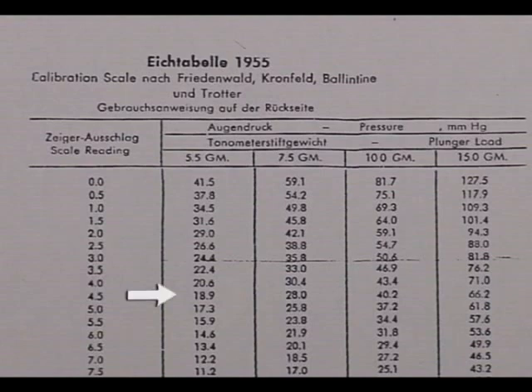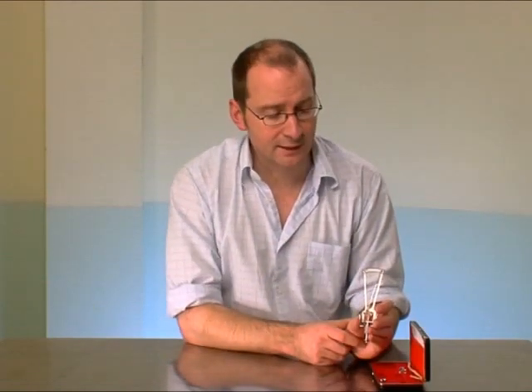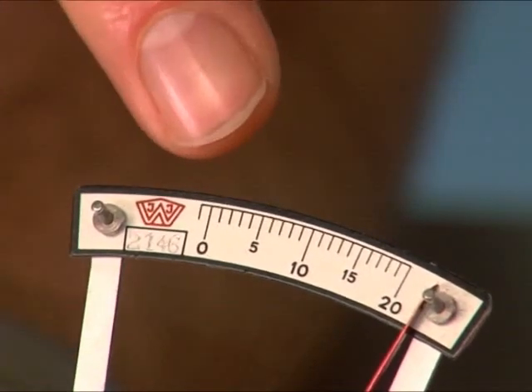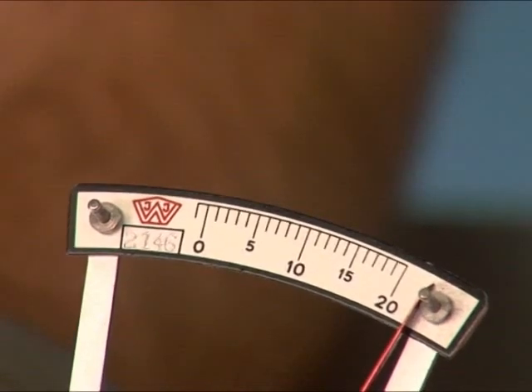in millimetres of mercury. Now, if the indentation is not very much, because the eye is so hard, you're going to get a reading less than 3 potentially, and it's not possible to be accurate with the intraocular pressure from the conversion tables with that value.